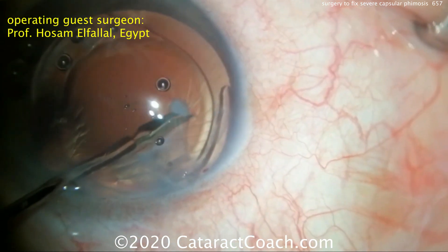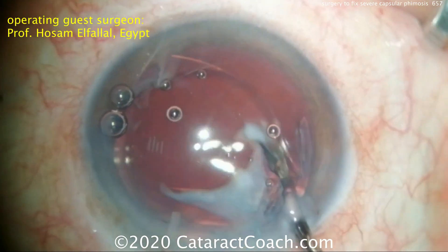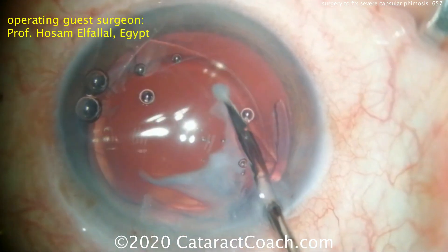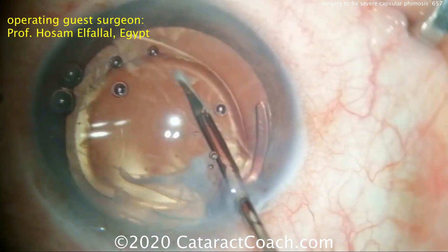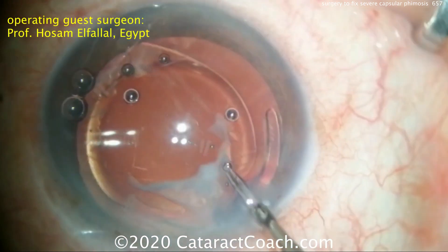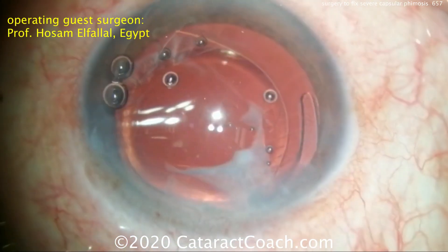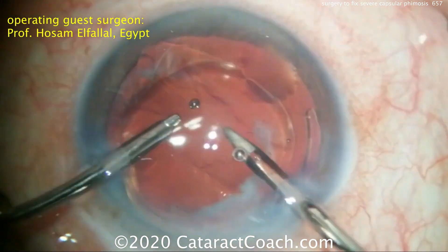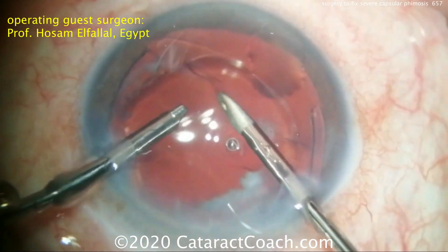This looks great — a beautiful case. We want to thank Dr. El-Falal for his submission and something for us all to learn from. How do you prevent capsular phimosis? You start off with a larger capsular rhexis, some surgeons put in a capsular tension ring in these cases, and if you see this early in the postoperative period you can do relaxing incisions of the anterior capsule with the YAG laser.